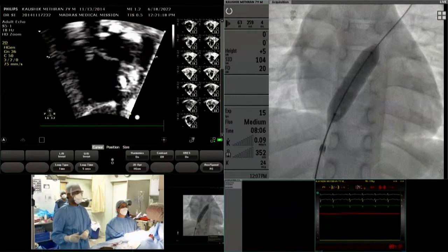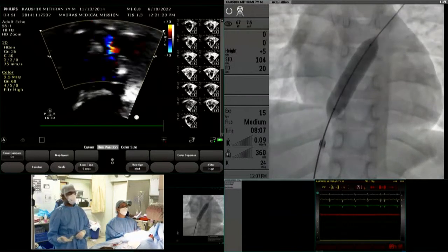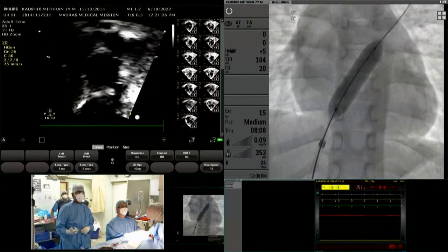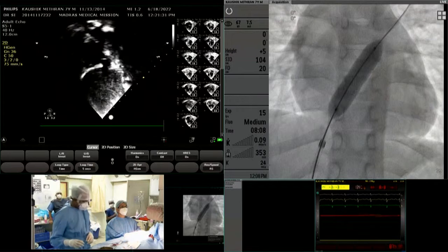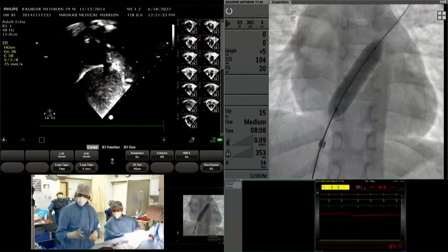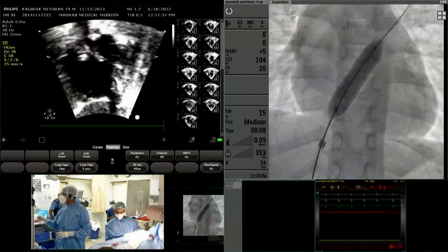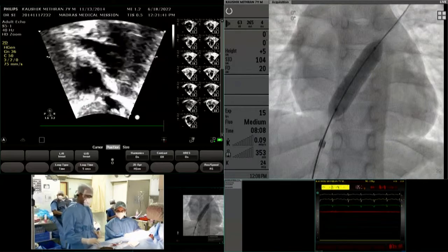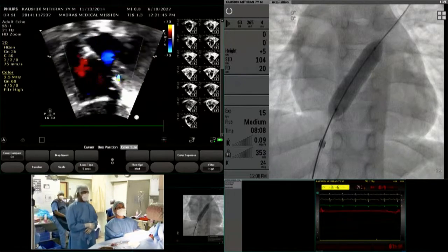Oh, okay, but so I have gone through some other hole. Actually, this is Pramod, what is happening is sometimes the color, no? Whenever there is a right to left shunt, your eyes will not catch the right to left shunt. That's why if you invert the color, you will see the shunt better in subcostal view. So you put it and you put a color and invert it. Can you invert the color? Actually, now you can see that. Yeah, we can see it now.